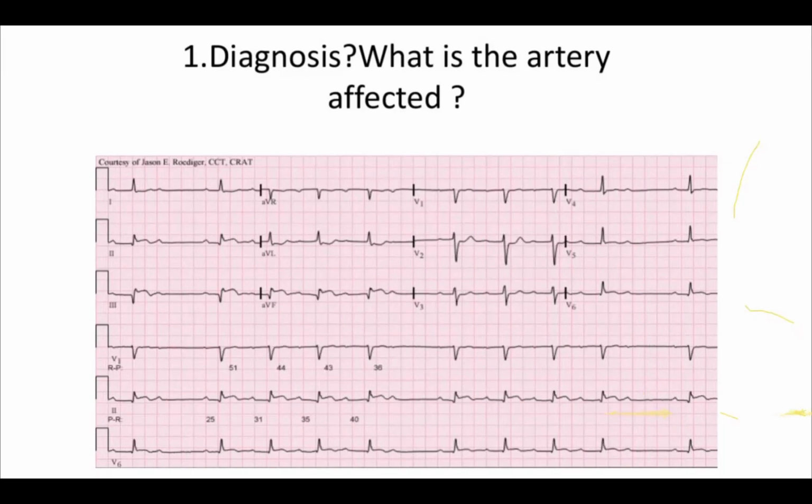So the next thing they will ask is, how will you confirm the diagnosis? What is the ECG you have to take? V7, V8 and V9 leads. Yeah, so you have to request V7, V8, V9. And always you can request at the same time the other lead. What is it? V4R. Yeah, V4R, because it can involve the right side, RV infarction, and then the management will differ.